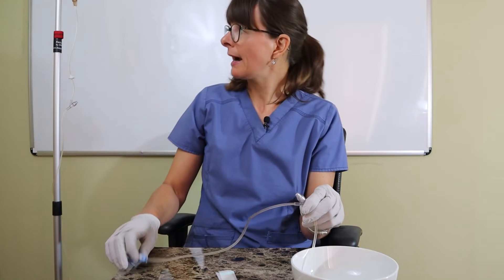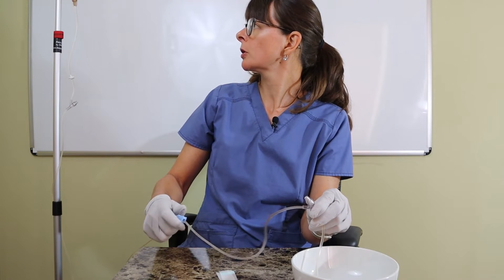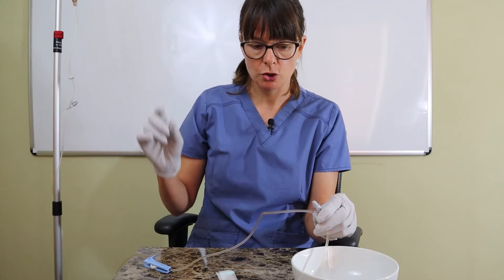My IV is going at a maintenance rate — I'm going to turn this on. And I can see in the drip chamber that it's dripping.